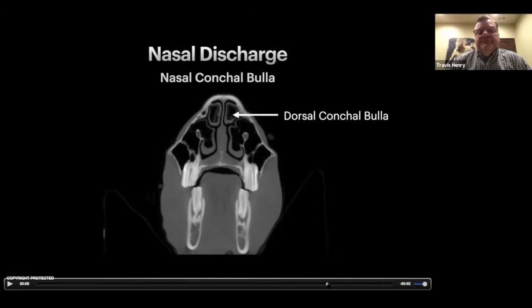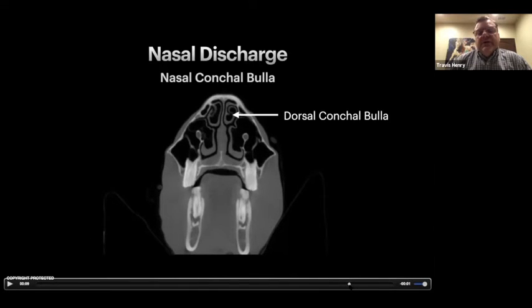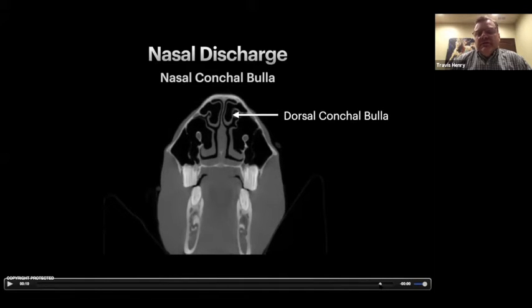So now we're fully into ventral conchal sinus here and rostromaxillary sinus here, and then here's our dorsal still here. And as we go back a little bit farther, then you can see the dorsal end, and then we can see the maxillary septal bulla come into play. And that's this structure here that's dividing rostromaxillary, ventral conchal from caudal maxillary and frontal and sphenopalatine. So this is our actual drainage angle coming out into the nose, but you can see that the bullas are gone in this region.